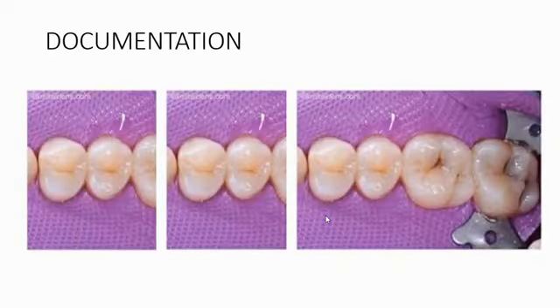And very important, especially those enthusiastic dentists who are documenting the cases or who want to take good nice pics with good isolation. So you can take same constant pictures with the rubber dam, which will give you nice documentation, photos, images. So these are the small benefits which I have told you, and a lot of other benefits also are there which you will start seeing when you practice.